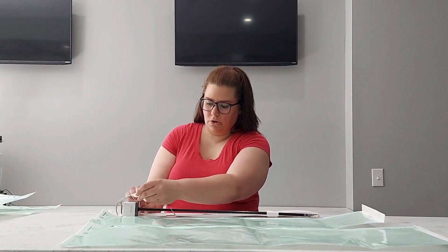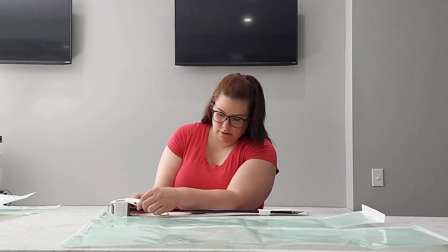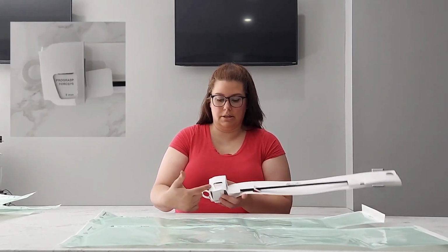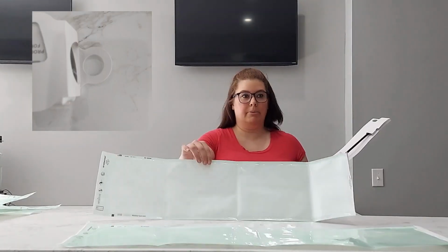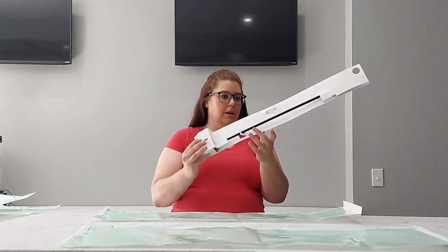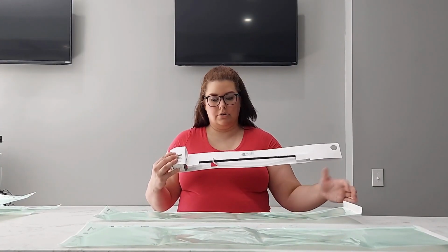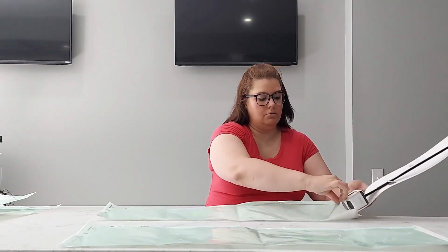So it's super simple. All we're going to do is take this and put it like this, so that this piece right here is holding the arm of the instrument steady. You can still see what it is, what millimeter it is. And then you have your peel pack, which you are then going to place your instrument in. There is a holder for your chemical indicator, which is nice so you're not just popping an indicator in there and hoping someone can see it. So you're putting it into the pack.